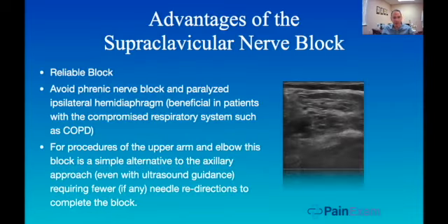And if a patient was going for surgery and needed 20, 30 mLs of local, even 30 is a lot in this area, maybe 15 to 20 mLs in the supraclavicular brachial plexus, I don't know if I'd sit him up like this. Maybe I wouldn't, and I'd just give it slower. But it's very easy to do it this way. And I find it to be a lot safer because you're aiming anteriorly and not at the lung.